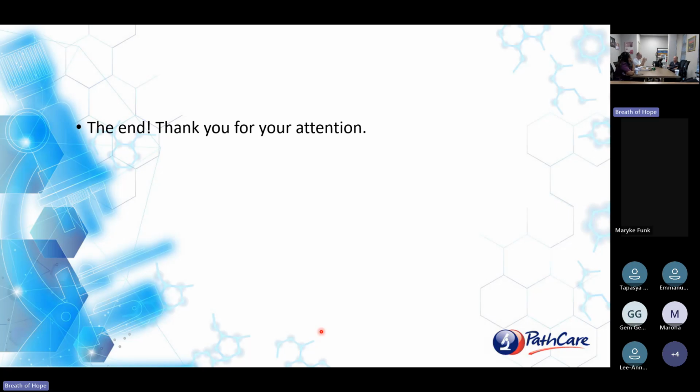The TEG will help you make that decision. You might also, from your clinical judgment, decide that this is what the patient needs, and give it. And the outcomes will probably be the same, except that maybe you use more blood products because you're not being as precise with your treatment. So where the TEG has been shown to be useful is in choosing blood products to give the least amount of product to the patient to give you the equivalent outcome at the end.